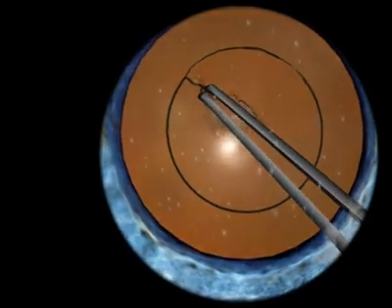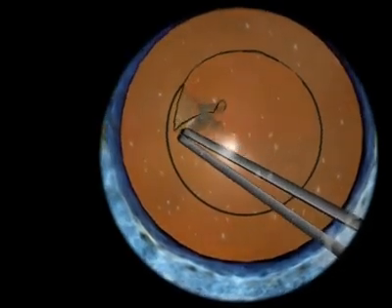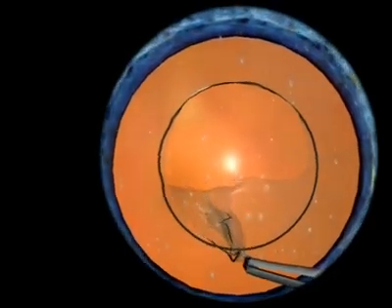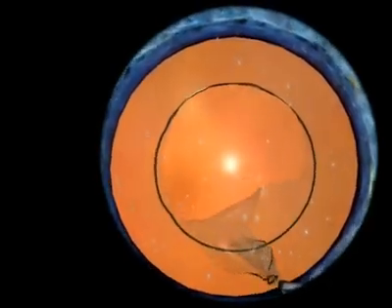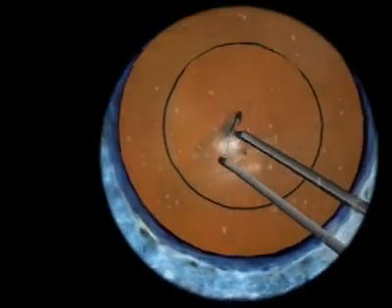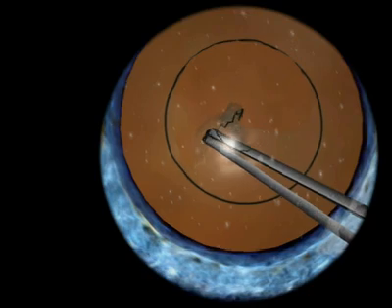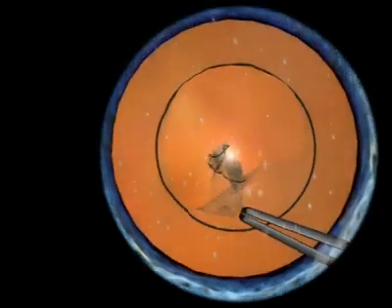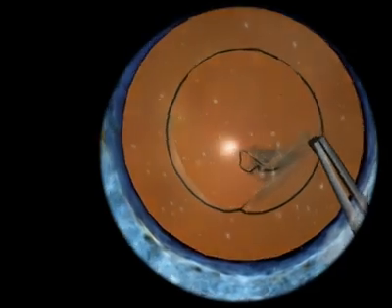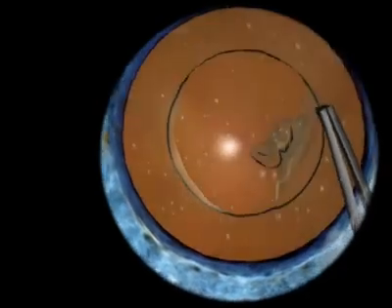Redirecting the flap is relatively straightforward and very similar to that of a real Rhexis, although the tissue characteristics are slightly different. You can see that centration is an important part of this, and I'm having a little trouble keeping it centered, but I'm doing a reasonably good job. In that case, I grabbed underneath the flap instead of on top of the flap as I intended, but the tear is going fairly well.